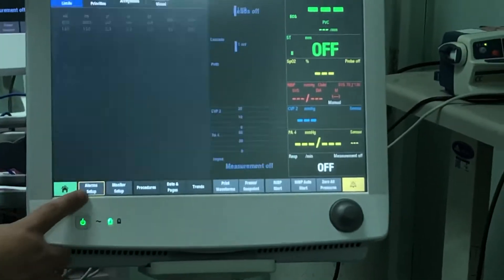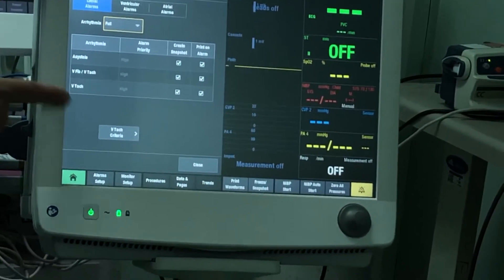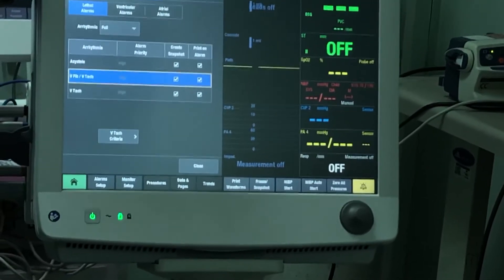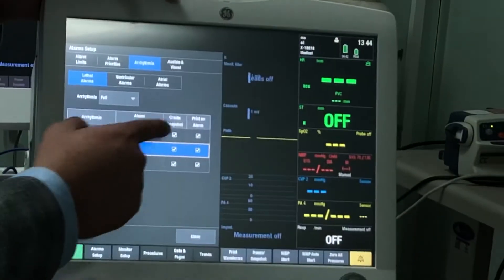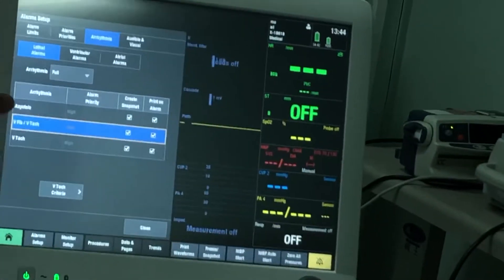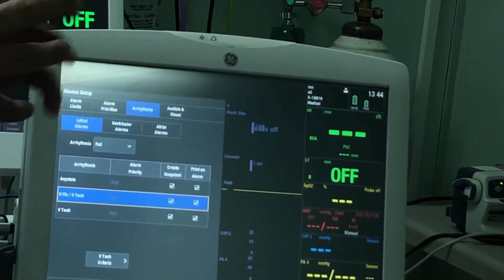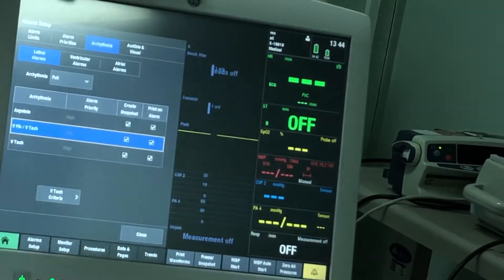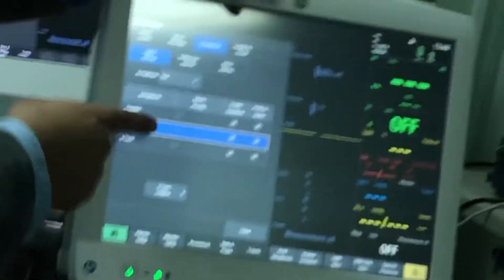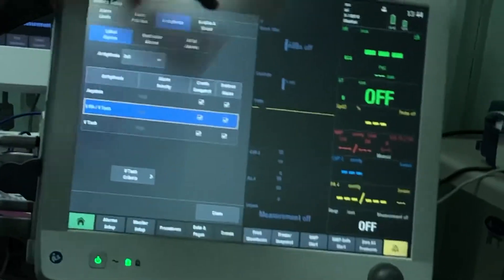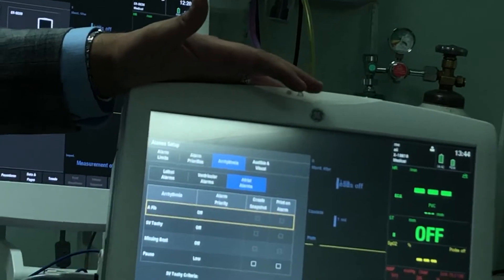For arrhythmias, it's a full license — the monitor tells you the diagnosis and alarms. Arrhythmias like VTAC and similar lethal arrhythmias are all high priority and cannot be changed. Even if you put the monitor on silence, these will break through the silence and still alarm. There's also a snapshot and print-on-alarm feature: if enabled, the monitor automatically creates a snapshot — like a screenshot — and sends a print order to the nursing station printer, printing whatever is on screen when the arrhythmia occurs. You can enable these options for ventricular or atrial alarms as well.